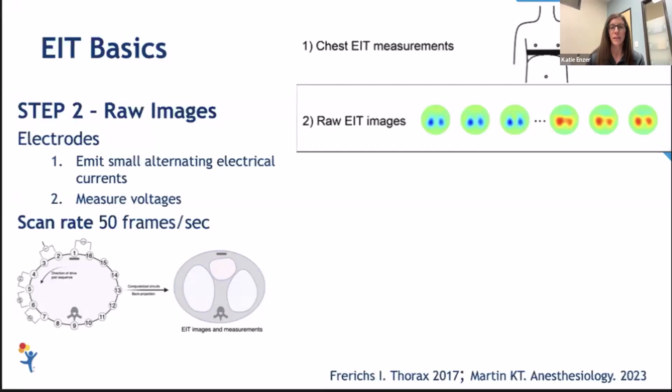So you can imagine the different impedance values of a normal healthy patient during tidal breathing, when the air moves in and out of the chest, versus a region of collapsed atelectatic lung or a pneumonia that does not change or has no variation during the respiratory cycle. While you're performing your EIT study, you need to make sure that you gather all the relevant data and see any condition that you're hoping to analyze, including different changes to ventilator support, positioning, breath holds, airway clearance, or anything else that you're hoping to capture.